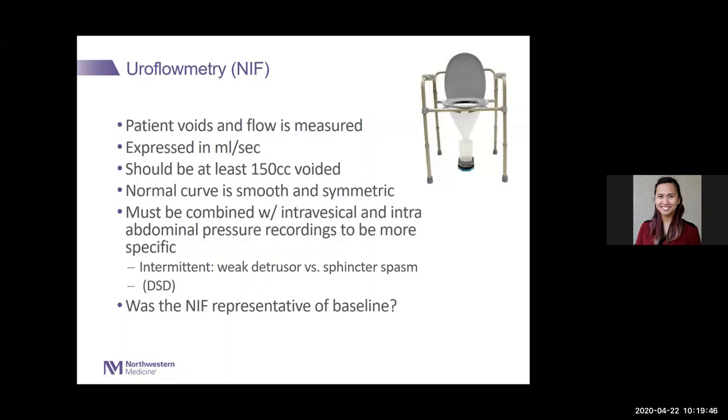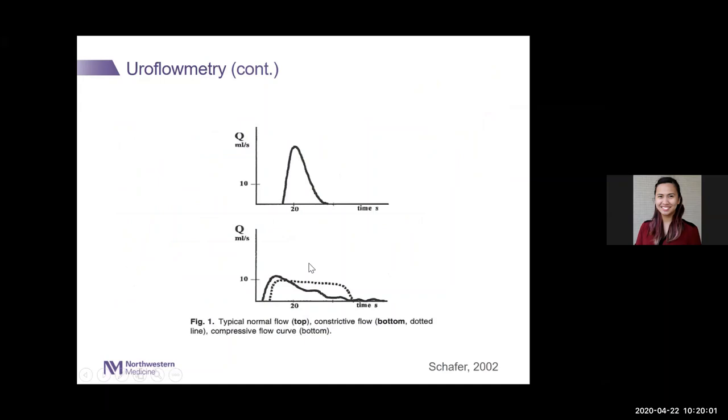And then if you want to do a more detailed study, you have catheters in, and that's the pressure flow part of the procedure, where you measure the pressure with the flow, against the flow. And you want to know, is this representative of what normally is going on? And those things we talked about may make it not completely valid.